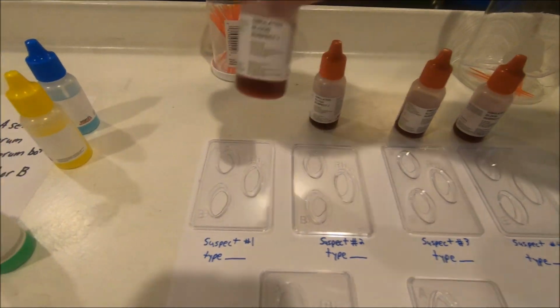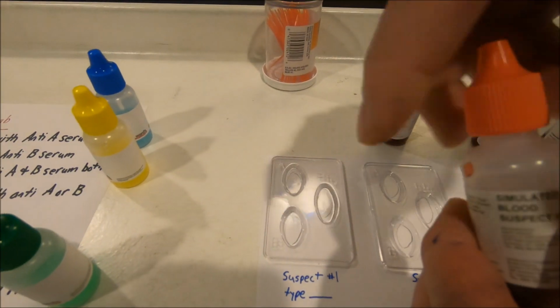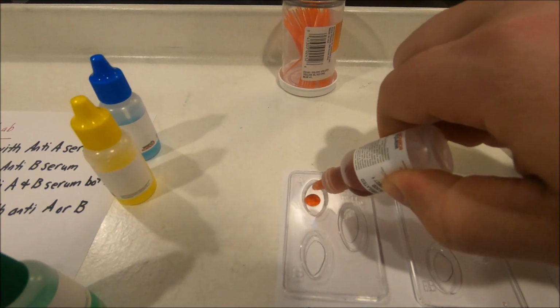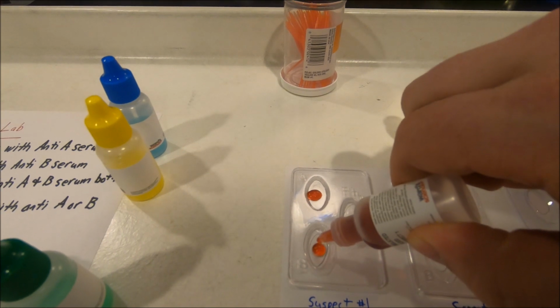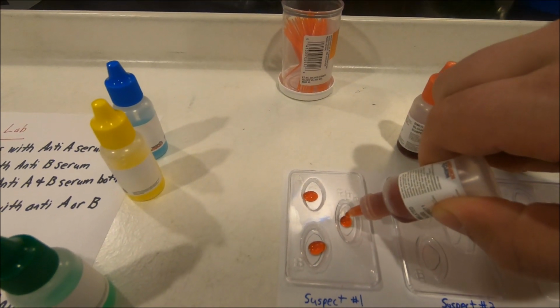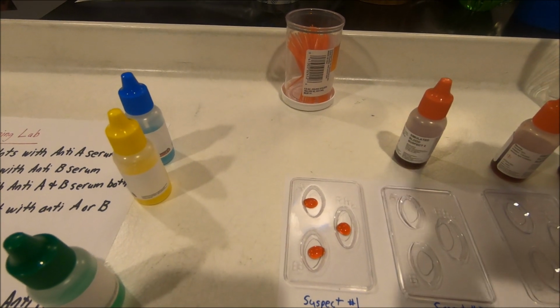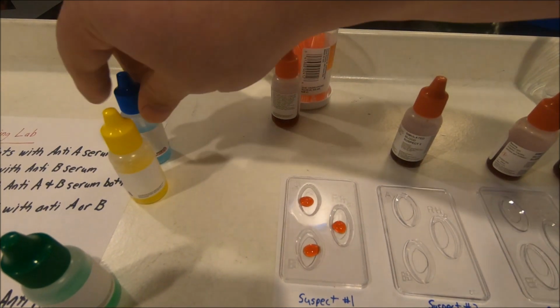So our first step with suspect 1's blood is to take 2 to 3 drops in the 3 different slots. And then we are going to take our serum.